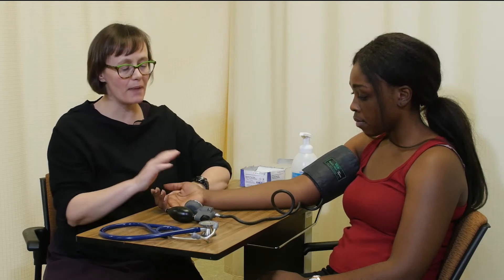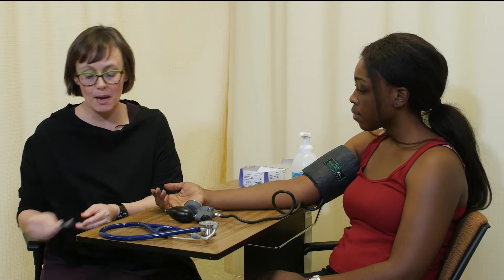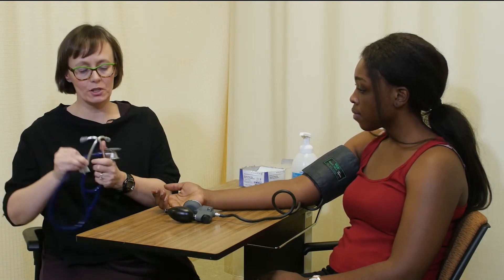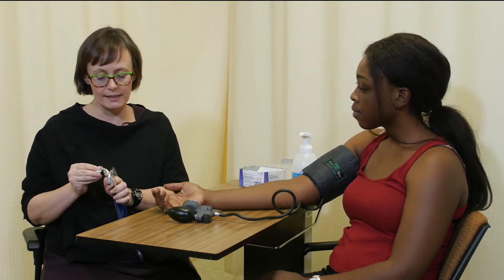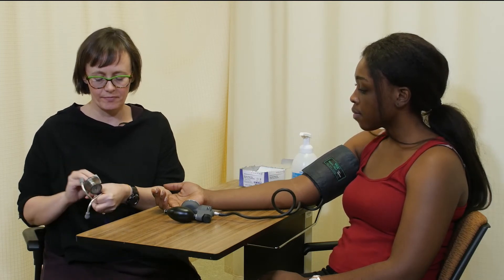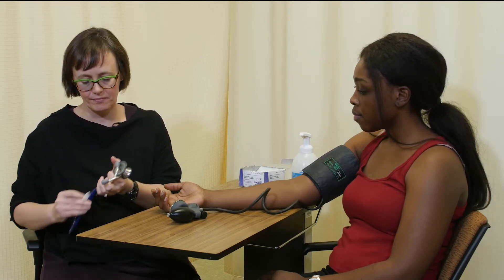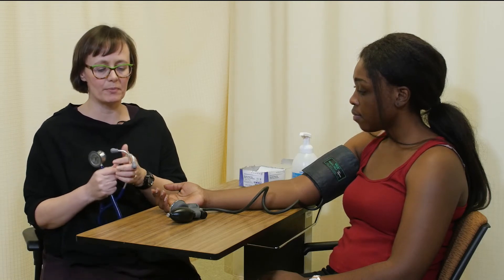Your maximum pressure inflation number is 130 millimeters of mercury — that's the number I'm going to pump the cuff to when I take blood pressure. Now we're ready to take blood pressure. Your arm is just going to reperfuse for about 15 seconds while I cleanse the stethoscope. And then we're ready.